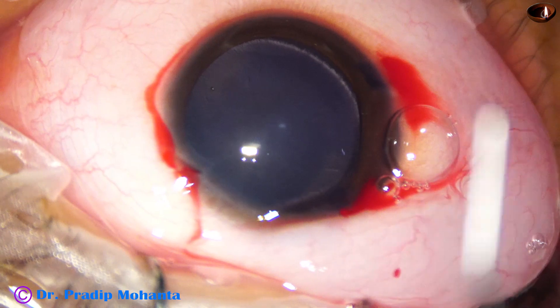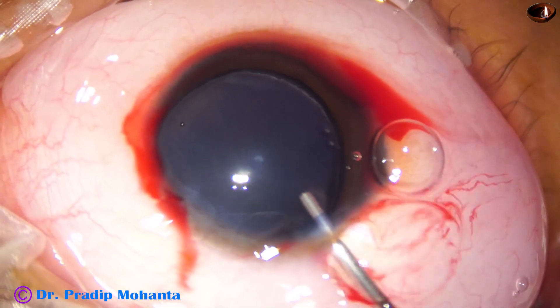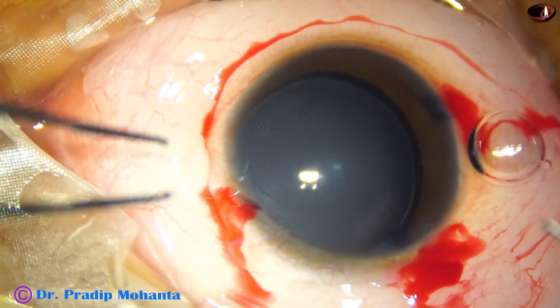Now the anterior chamber is filled up with 2% hydroxypropyl methyl cellulose. Methyl cellulose has also been applied over the cornea for better visibility.